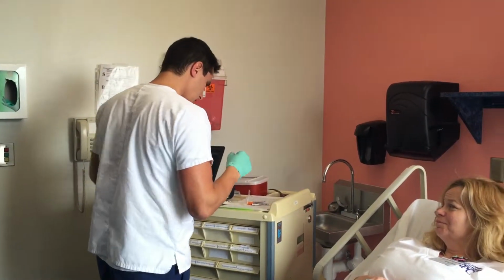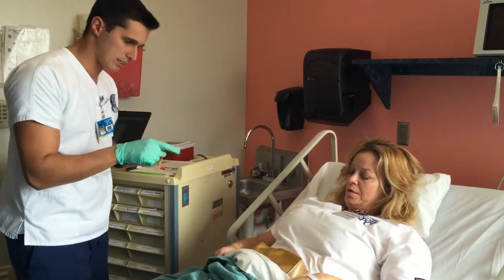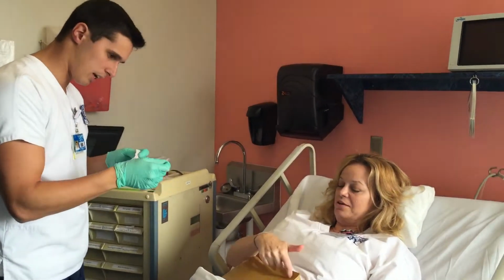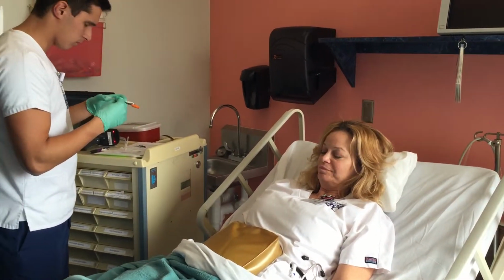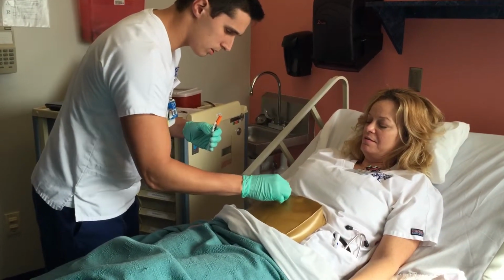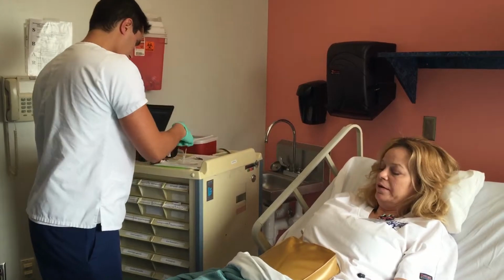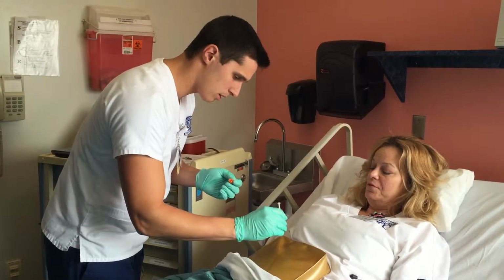All right. Are we ready? Yeah. When was the last time you checked? Which site? Let me think. I think they just did it here. So let's start with that grid thingy that you were talking about, because I think that's a good idea. All right. So, you said this side? Yeah, that'll work. That way I'll know my right side. Right here. And we want to clean this side just to make sure that it's clean, less risk for infection. Okay. And so, it's going to be a little poke. Okay.